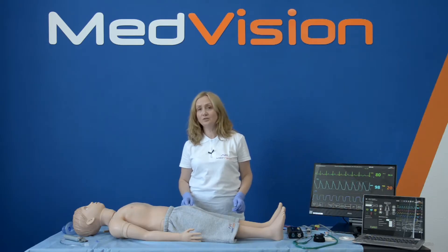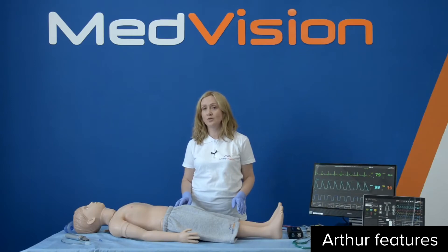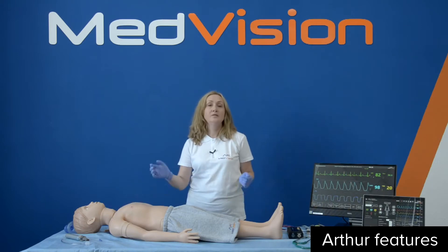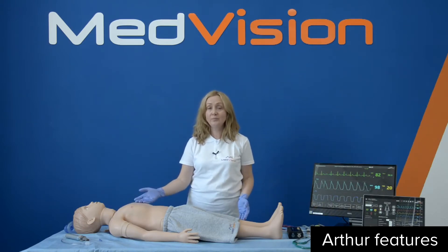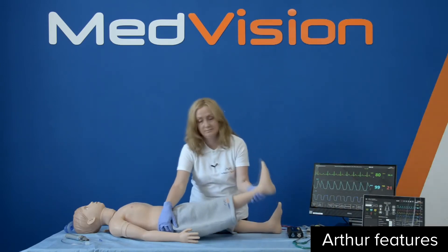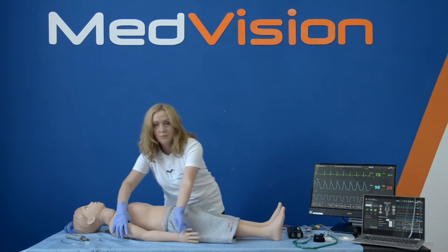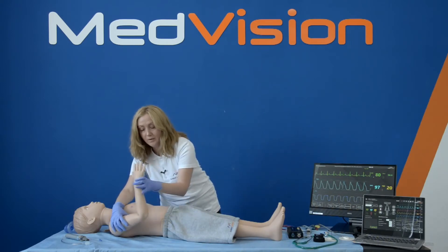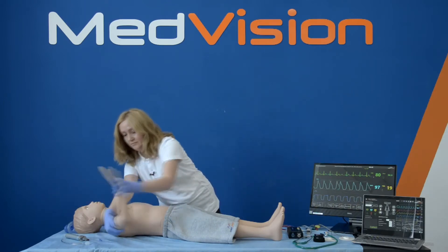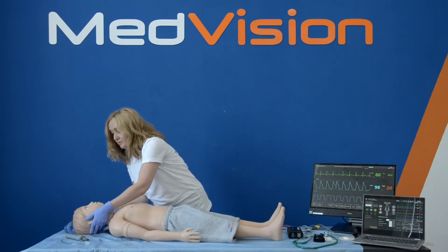Now let's have a closer look at the benefits and features of Arthur. Arthur supports realistic articulation in all joints, which means it has realistic articulation of the neck and the limbs. The neck and limbs provide true-to-life flexibility and resistance of the feet, hips, knee, wrist, elbow, shoulder, and neck — forward and backward and from side to side.